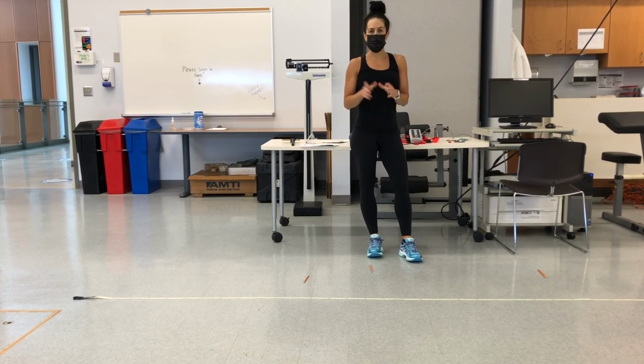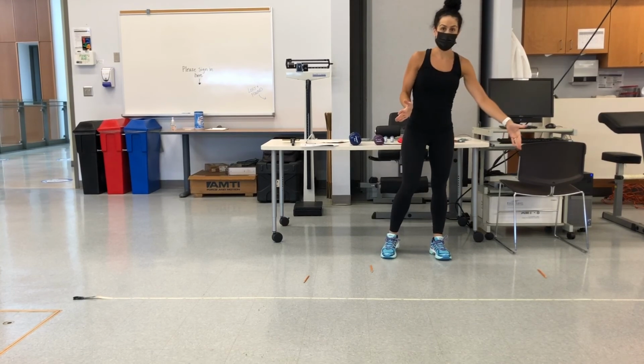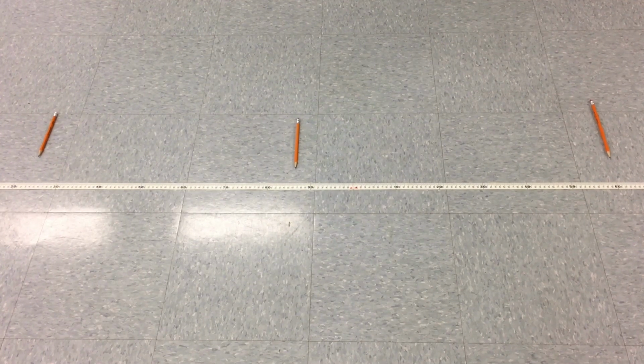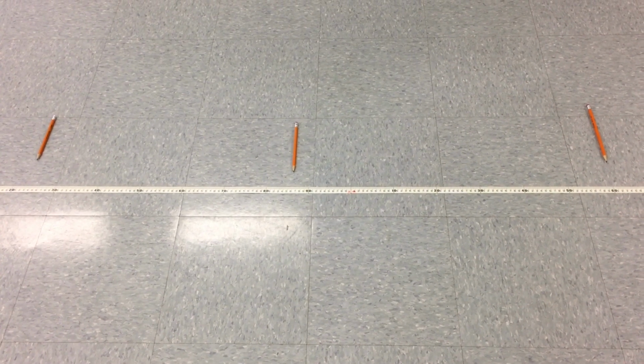And keeping in mind when we're dealing with the stride, it would be, for example, right heel fall to the next subsequent right heel fall, whereas a step would be right heel fall to the next left heel fall. And if you had 2 steps or 1 stride, that would be 1 gait cycle. This is much harder than it looks, so we truly appreciate the Gait mat.